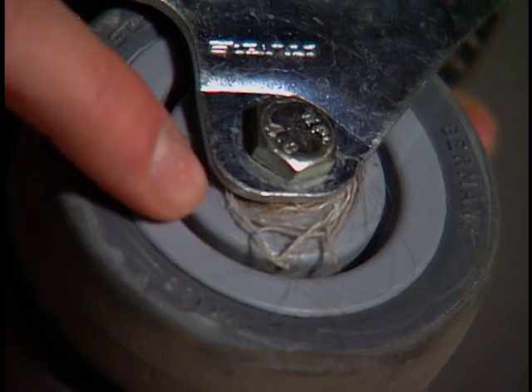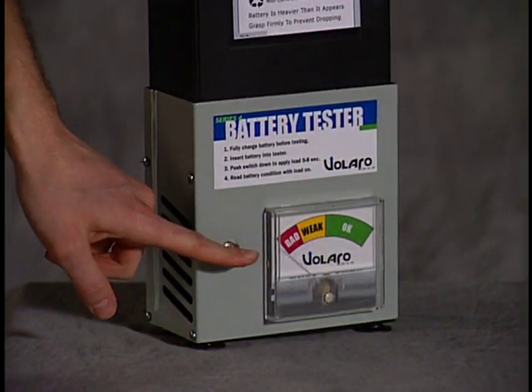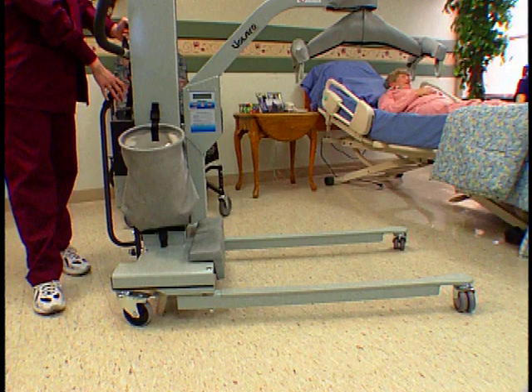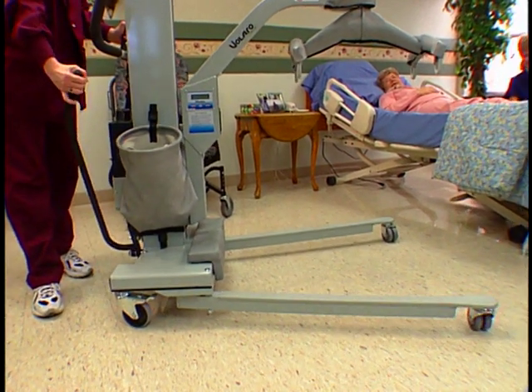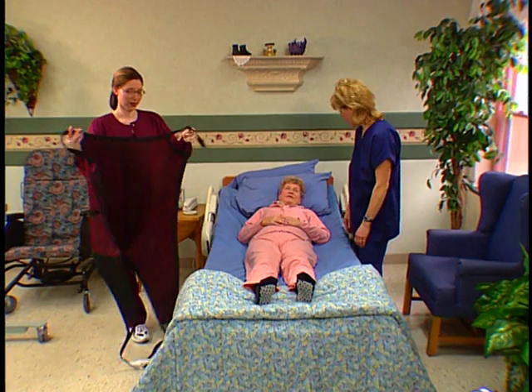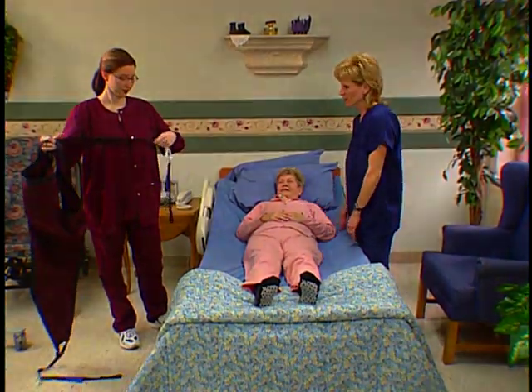Be sure to examine the casters for excessive debris and check that the battery has sufficient charge to complete your transfer. In addition, always plan the transfer pathway, removing any obstacles which may obstruct your movement. When possible, we recommend that transfers be completed with the legs in the widest position. Finally, prior to lifting, greet and explain the procedure to the resident.